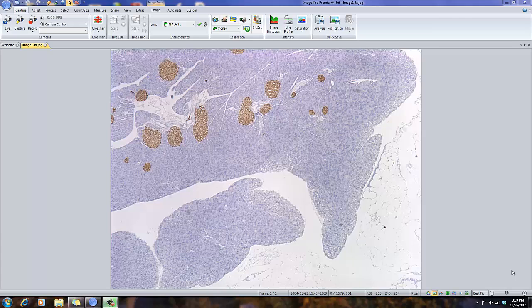This is a short movie showing ImagePro Premiere version 9 in the DAB analysis app. The main purpose of this application is to calculate the area and integrated optical density of the stained region or areas.